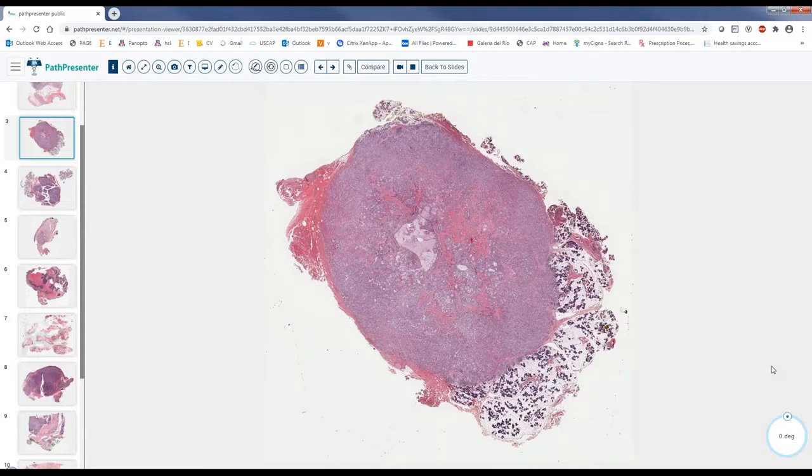If you see it ill-defined, that is what you're kind of looking for, but usually if you see this, I'm dealing with benign versus low-grade. This is usually the salivary gland, and basically they sum both the benign and low-grade malignant tumor in one category, and they put the high-grade carcinoma in another category.